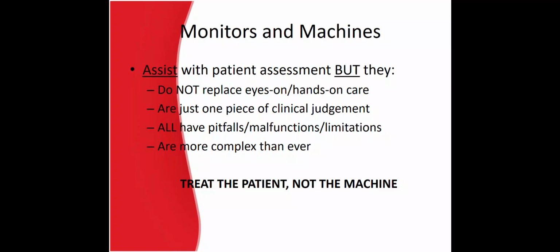Monitors and machines assist with patient assessment, but keep in mind they do not replace eyes-on, hands-on care. They are just one piece of clinical judgment. They all have pitfalls, malfunctions, and limitations, and they are all more complex than ever. Remember to always treat your patient, not the machine.